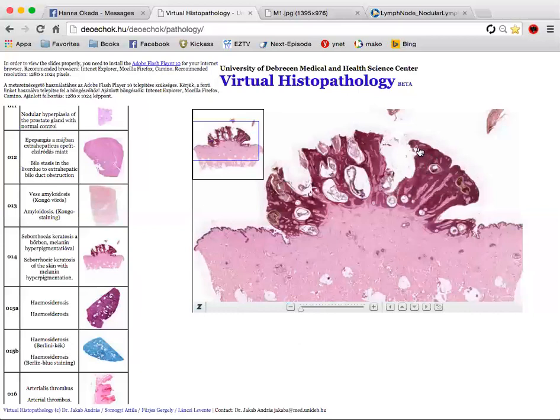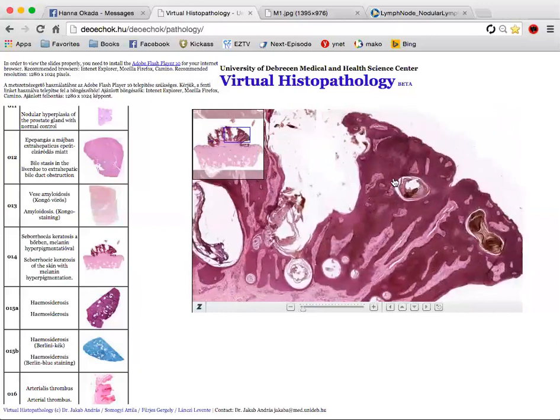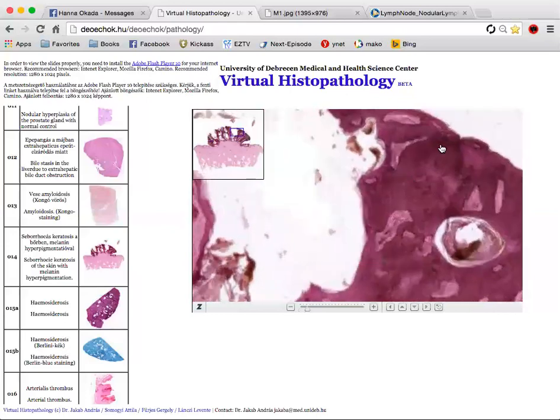It has this epithelial component and this connective tissue component that kind of looks like dermis, and the horn cysts that are filled with keratin and melanin. Okay, and there's melanin hyperpigmentation in the epithelium. That's why it's darker.